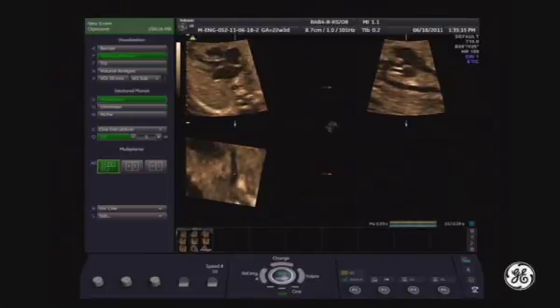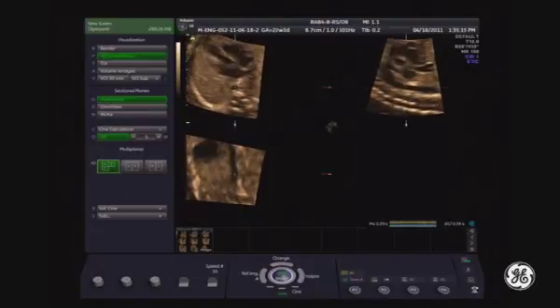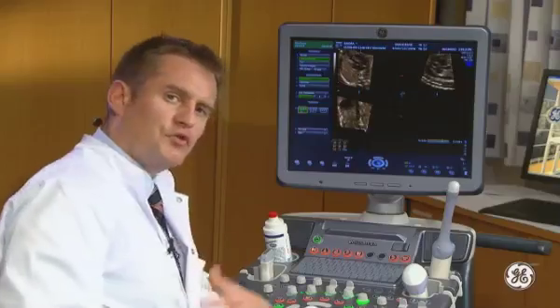You can see that the A-plane needs to be rotated, so I'll do this first. You can see it now. It has to be rotated a bit more. And when you are properly orientated, you can see that the dot is displayed here as a transverse cut through the descending aorta. In the B-plane, you will get the ductal arch view, and in the C-plane, you will see the descending aorta vertically. So this is the proof that your orientation was perfect. Now we'll go to the next step.